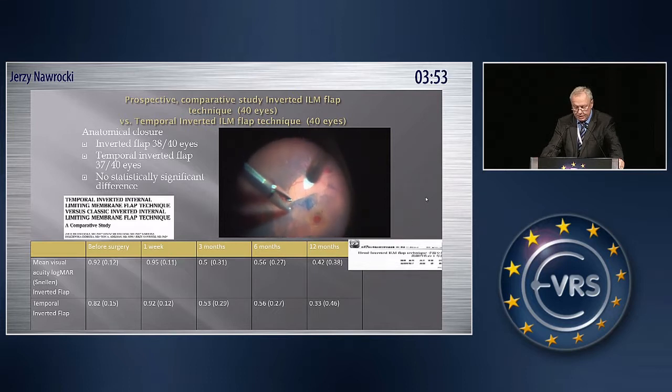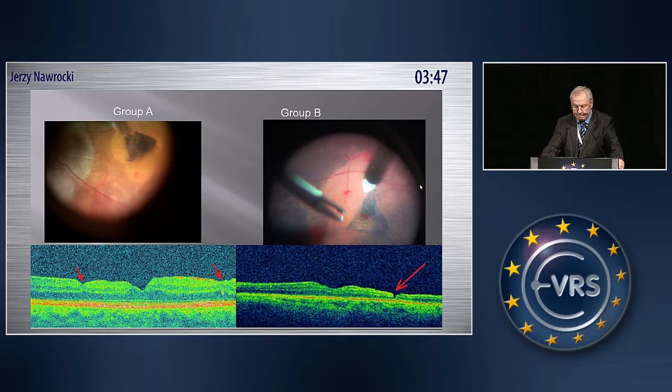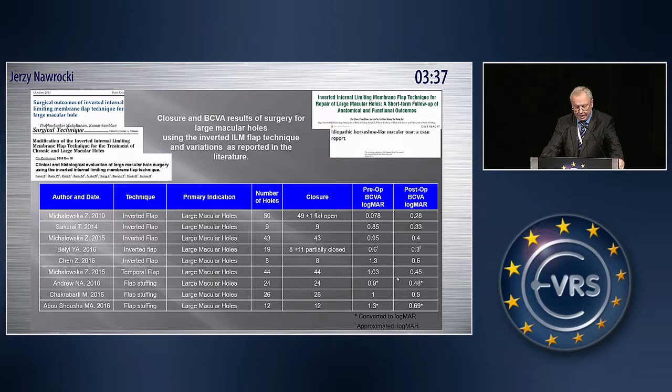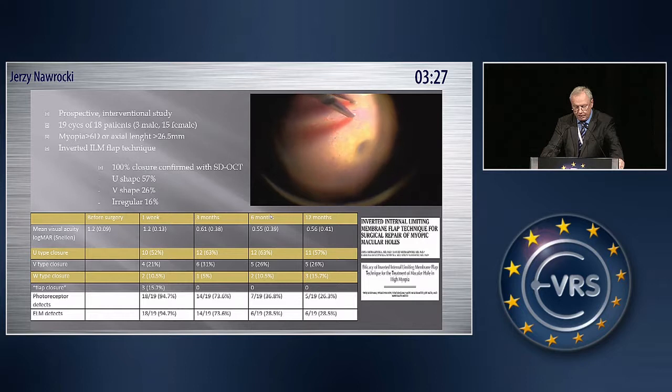The results were statistically without significant differences between both techniques. But what we get with the temporal flap, we get nerve fiber layer defects only on the site where ILM was peeled. Currently, we have several papers confirming this technique for large macular holes. And also we have papers confirming that for myopic macular holes.